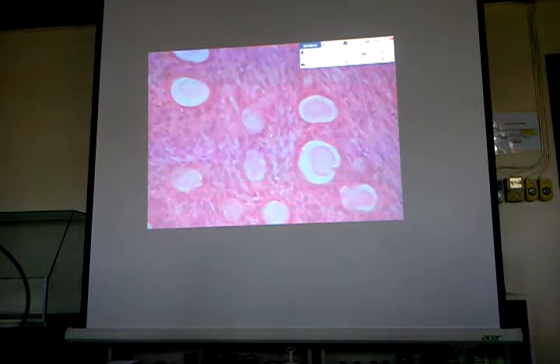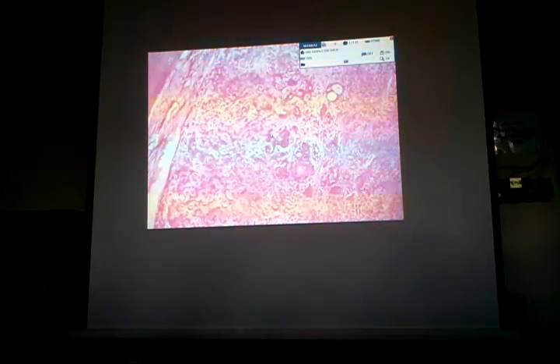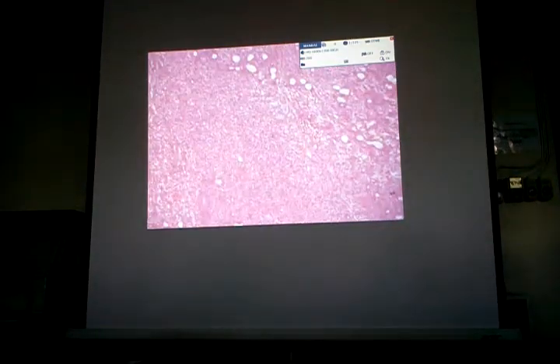Mayroong epithelial cells forming glands. And then sometimes, we will be able to see cartilaginous tissues within this tumor. That area is also showing aggregates of tubules and ducts. Sometimes there will be plates of hyaline cartilage that will be present in this tumor.